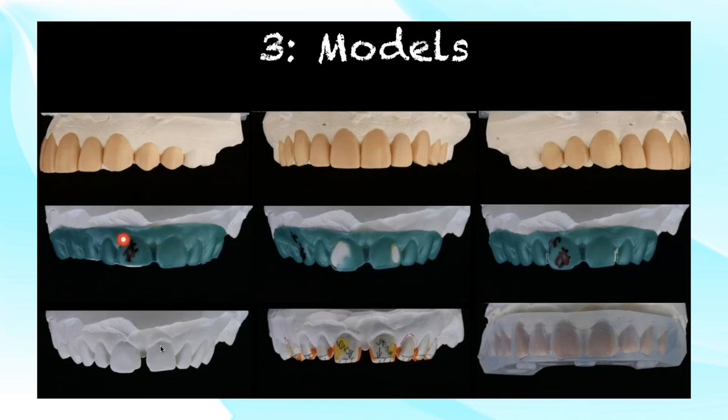So the first template we see down here is only for the incisal reduction. So we can see some incisal reduction done right here. After we do the incisal reduction, then we're going to do the facial reduction, which is right here, and then the interproximal reduction, which is right here. Okay? So what I really, really want you to look at is how minimally invasive this is.